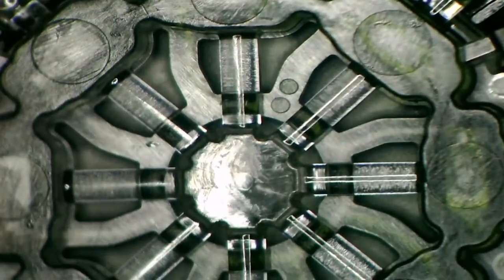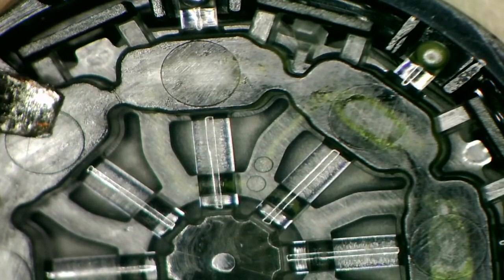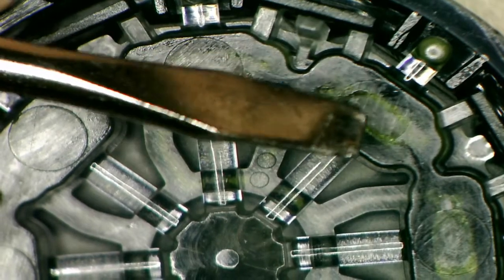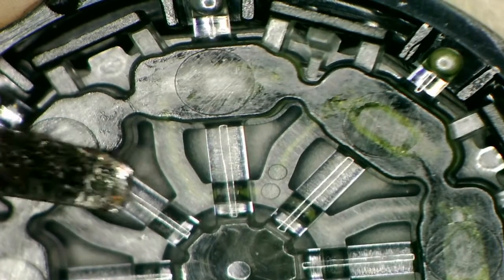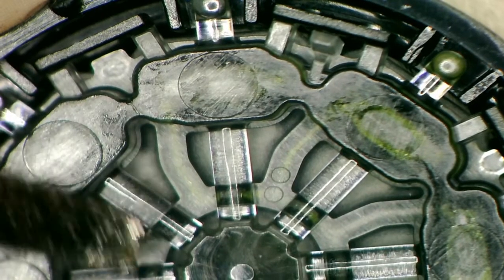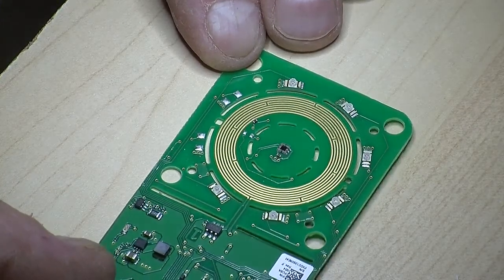The circular thermal paste, or the circular thermal strip, attaches the heater to these pads here in the plastic assembly that somehow heat up the goop that's probably somewhere in this maze of optical waveguides and probably pipes carrying the goop, and that's where the processing takes place. So anyway, that's really interesting to see what's in there.